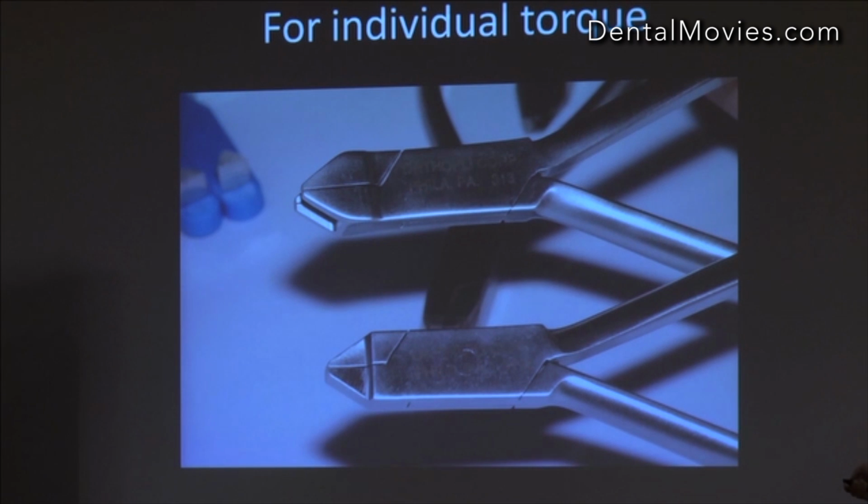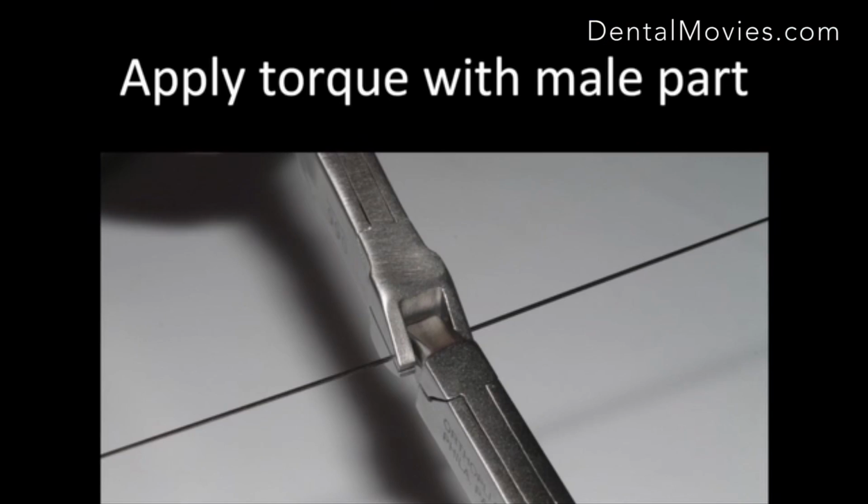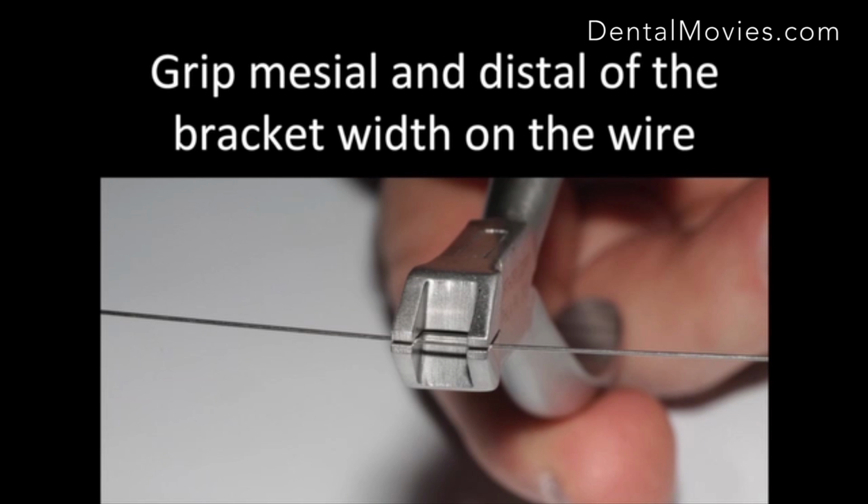And they come as a set. You grab the part of the wire you want to put the extra torque in. And now, do you get this? There's a male and female part. What do you think the male part is? Do you apply the torque with the male part? Right? So this is the female part.